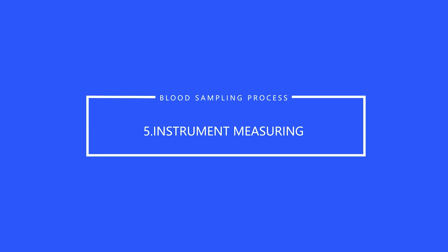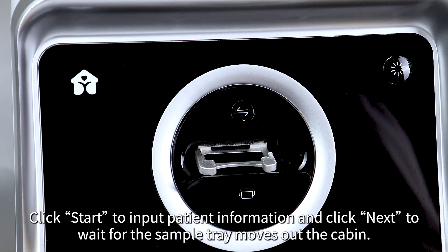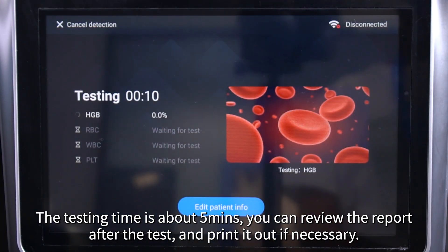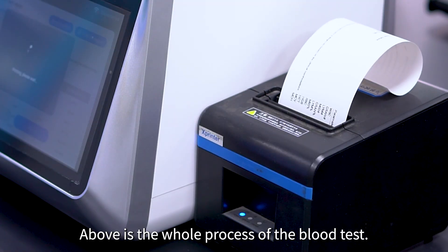Instrument Measuring. Power on the analyzer and log in to the software. Click Start to input patient information and click Next to wait for the sample tray to move out of the cabin. The testing time is about 5 minutes. You can review the report after the test and print it out if necessary. Above is the whole process of the blood test.